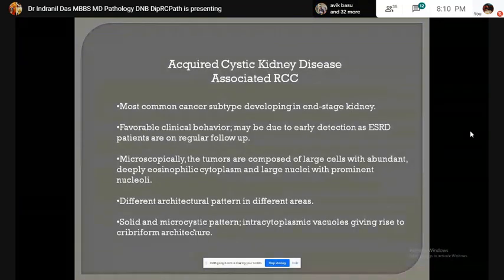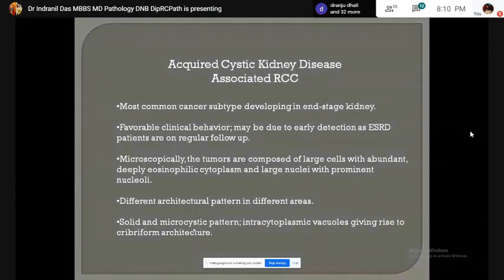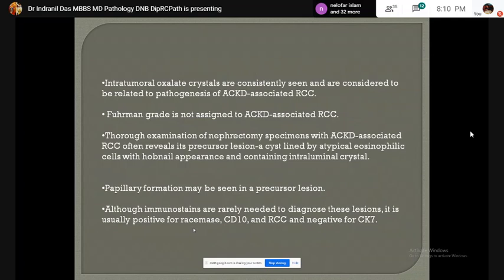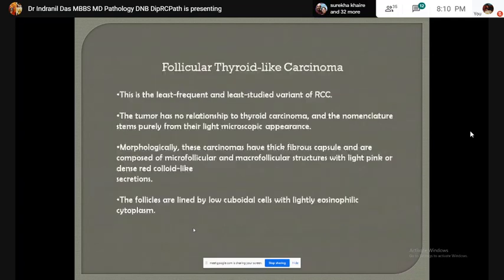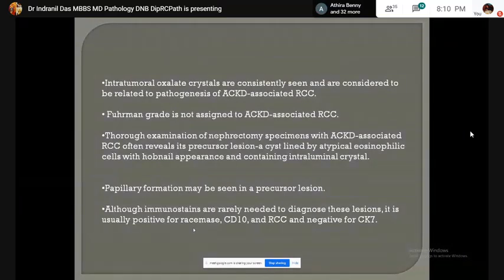Acquired cystic kidney disease-associated RCC develops in patients with end-stage renal disease. Microscopically, they show a solid, tubuliform, or microcystic pattern, composed of large cells with abundant eosinophilic cytoplasm and large nuclei with prominent nucleoli. Intratumoral oxalate crystals are a very characteristic finding. They are positive for CD10 and AMACR, and CK7 is negative.